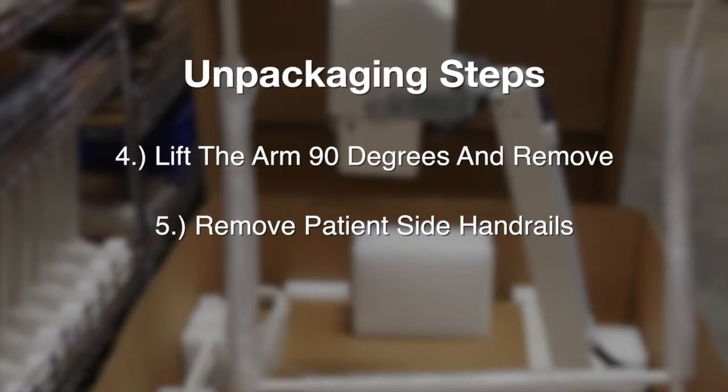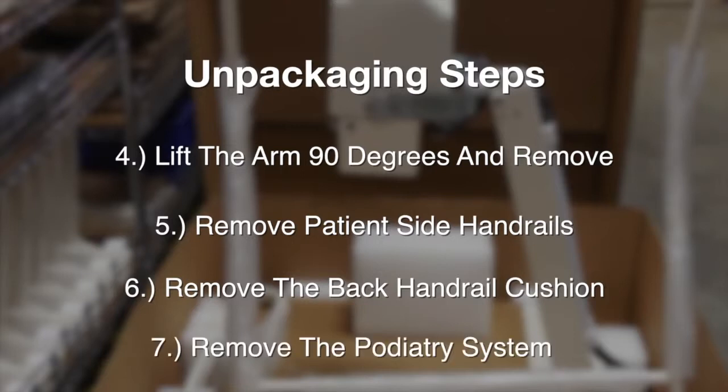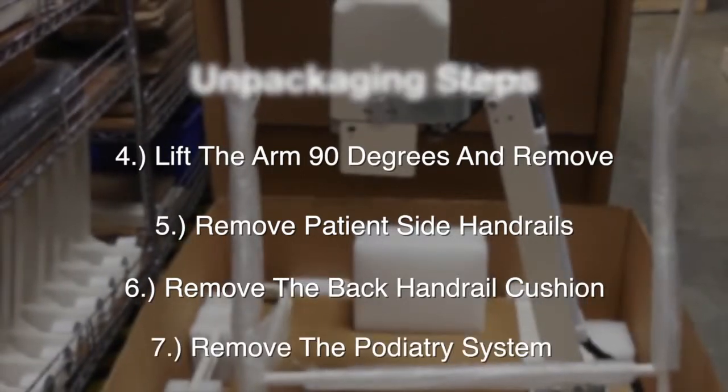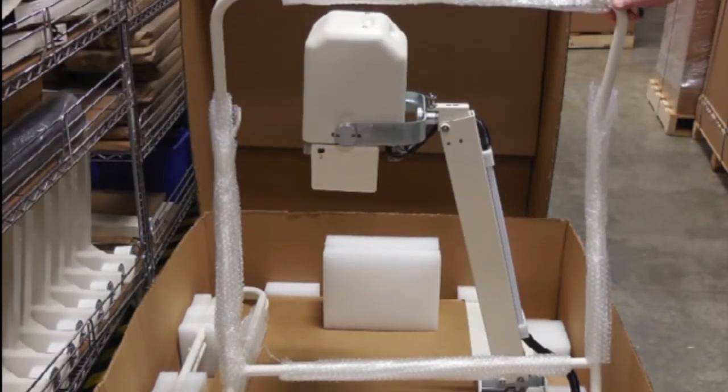Next, remove the patient side handrails from the cushions. The back handrail cushion should then be removed and set aside. You want to then remove the podiatry system from the base and set aside. We are now ready to begin the installation process of the PXS710D.